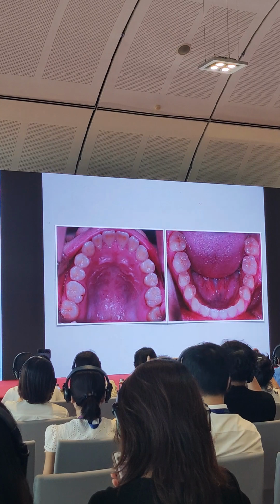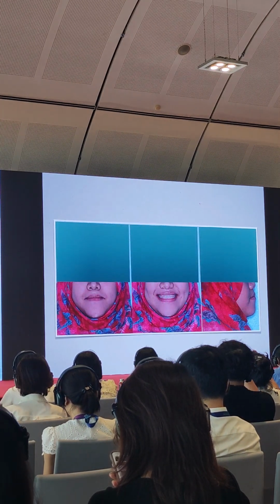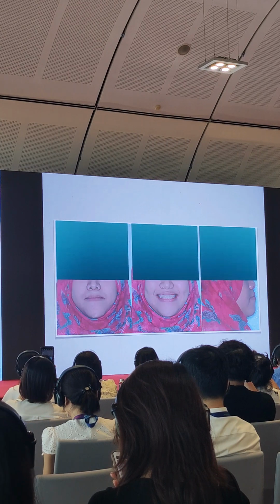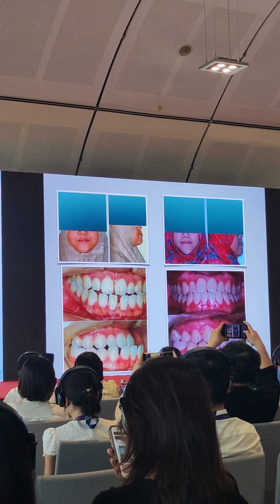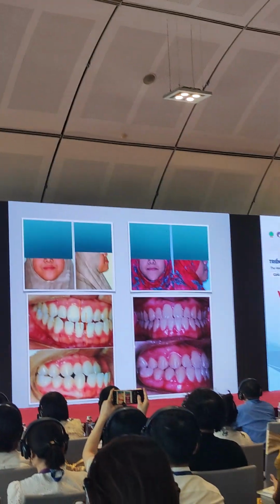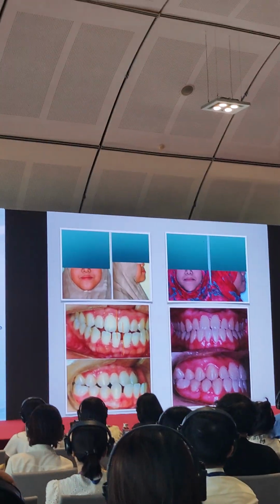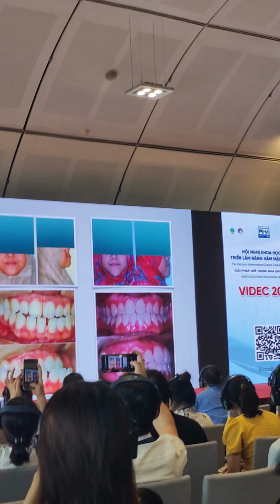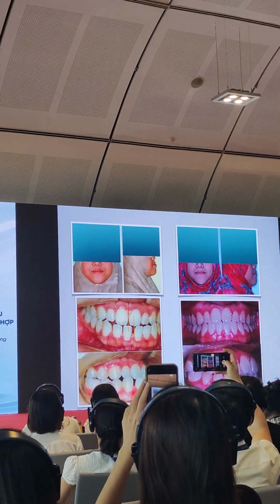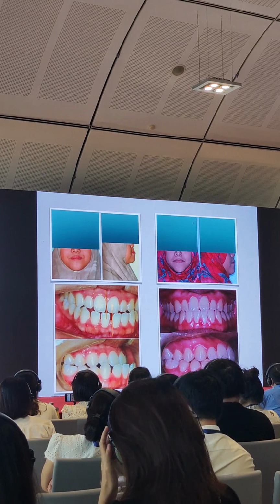So this is the occlusal view and the profile of the patient. If you compare the before and the after, you were able to move the mandible a little bit backward by rotating it and correcting the midline. Although there's a slight midline deviation, you can still move it probably, but it will become more class 2 on this side. So that's why we removed it already.